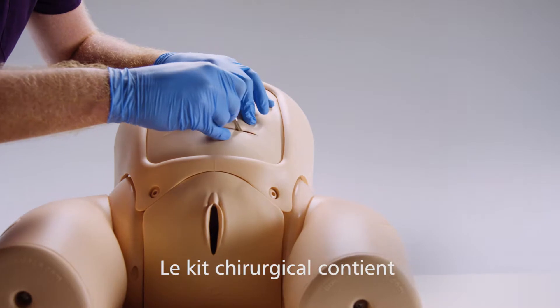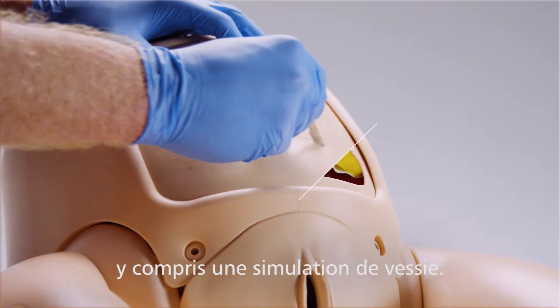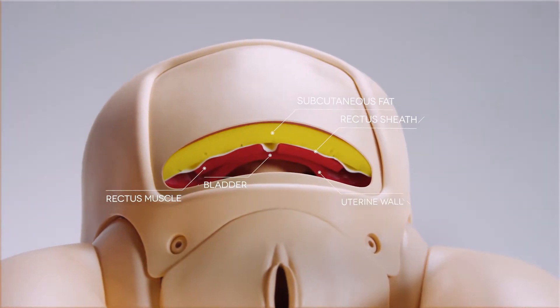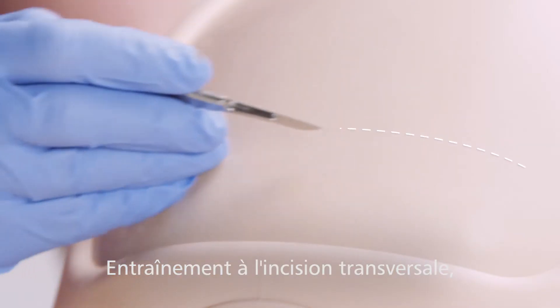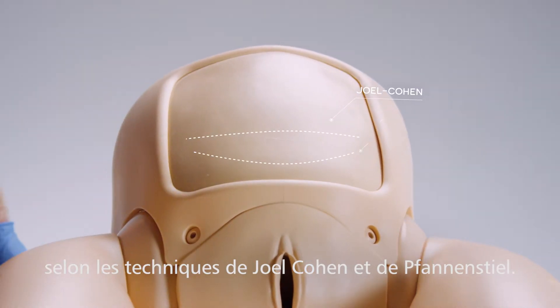The surgical pad contains all important anatomical layers and includes a simulated bladder for realistic representation. It allows training in performing a transverse incision, both Joel Cohen and Pfannenstiel.